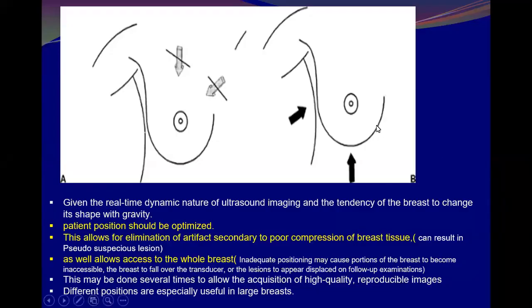Early on in mammography techniques, we discussed that the breast is fixed on the medial and superior part and mobile on the lateral and inferior part, and how we could manage this while doing mammography. Today, we want to know what the impact of this is in ultrasound examinations.